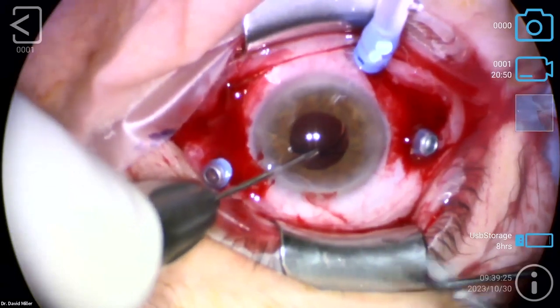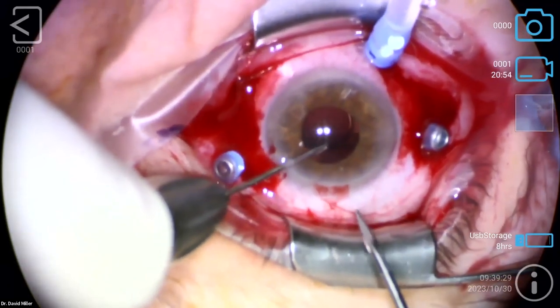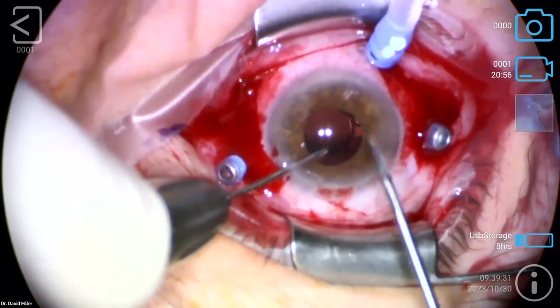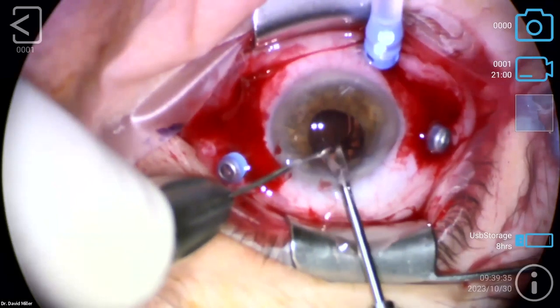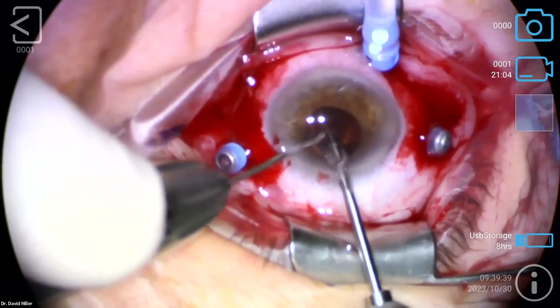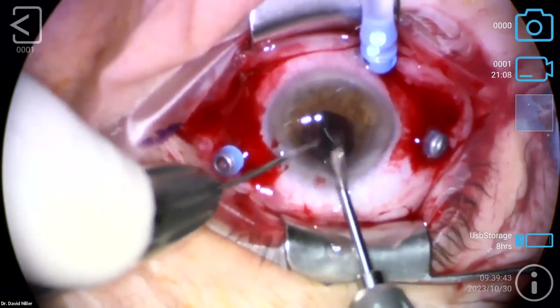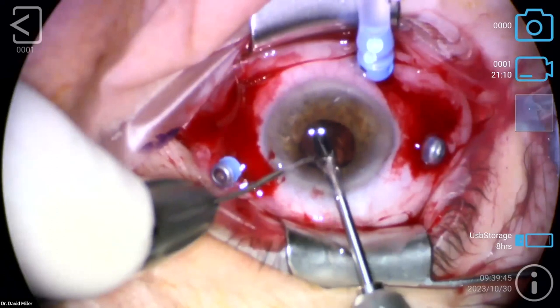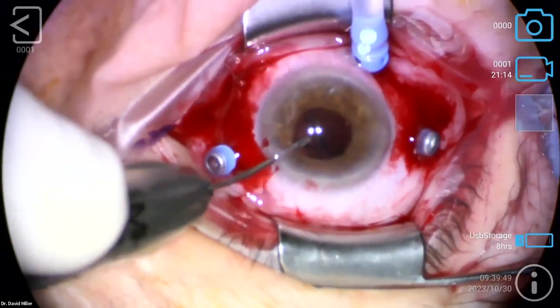These are MST forceps and scissors. And there's just two of them here. And once the scissors grab it, we perch it, you know, I can hand it to myself like that and grab it even better. So what I'm going to try and do is just cut it right down the middle, just behind the iris like this. And that usually works pretty well.